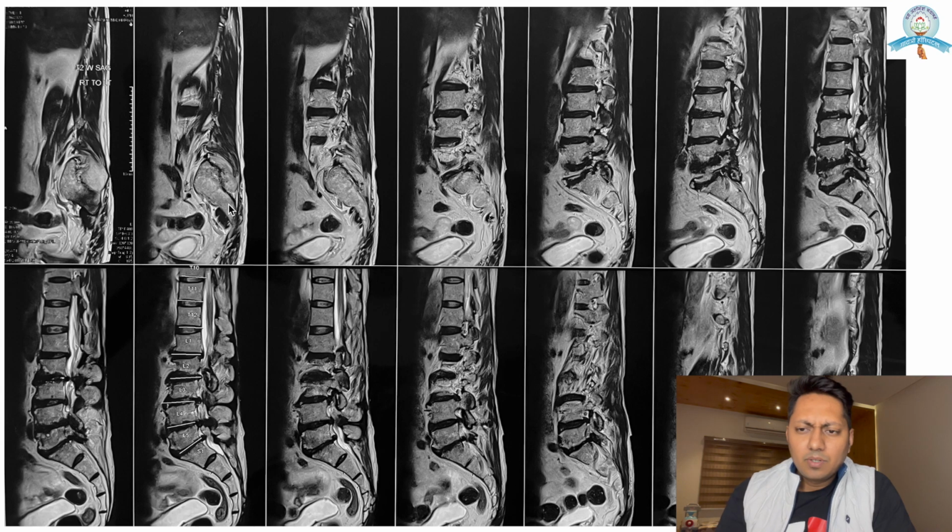I tried to diagnose his cause of pain, and I'm going to explain to you how I read my MRI to find out what is the causative factor in this patient. Since on clinical examination his right side L4 and L5 nerve roots were involved, I'm going to trace those nerve roots back into the spine and see where these nerves are getting compressed.